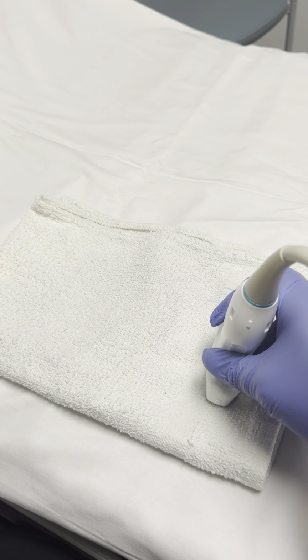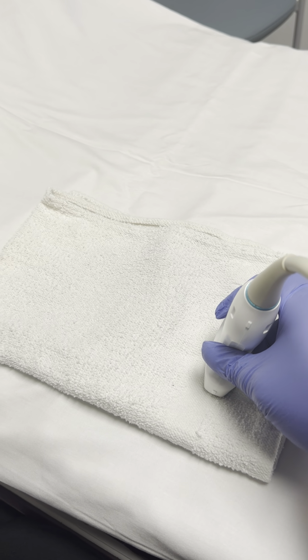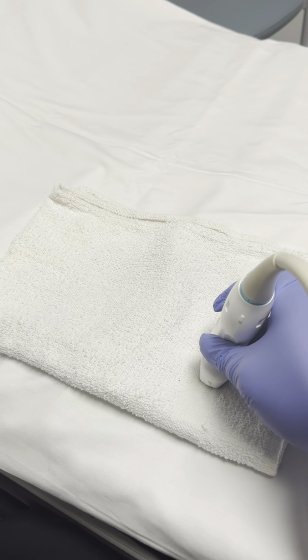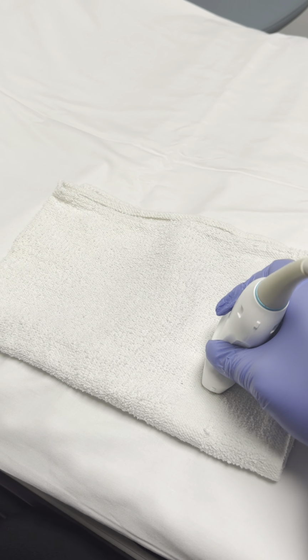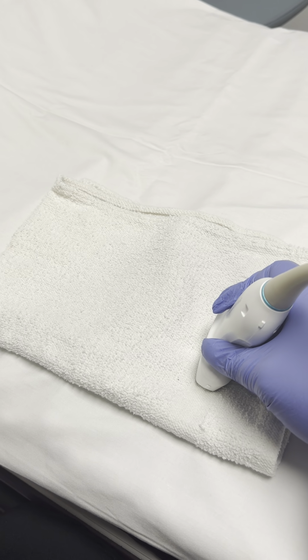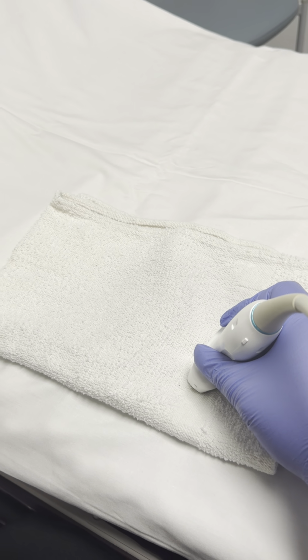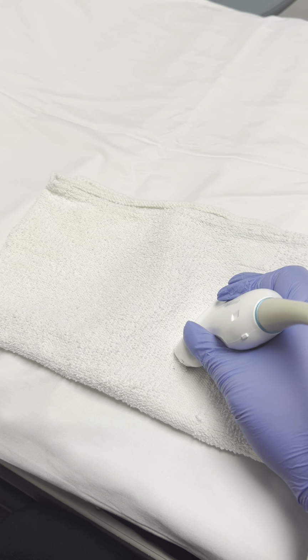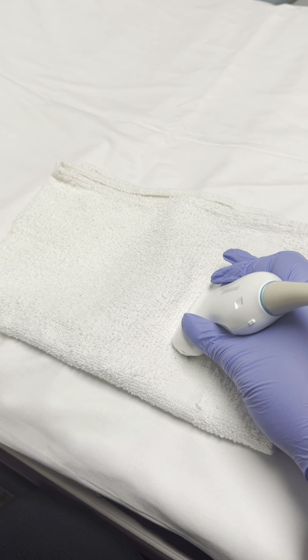As you're sweeping through, remember 4 chamber, LVOT, RVOT. You just kind of angle like that, sweeping through the baby. So LVOT is slightly on that left side. RVOT, you may have to tilt your probe just like that as you're sweeping through the RVOT, kind of just angling like that up into the mediastinal structures.